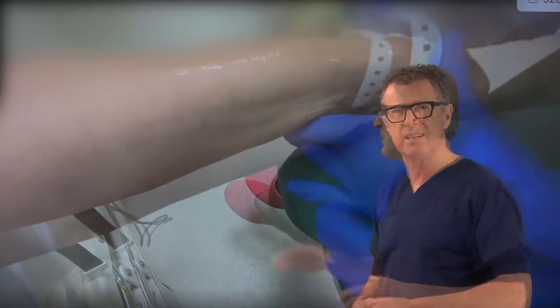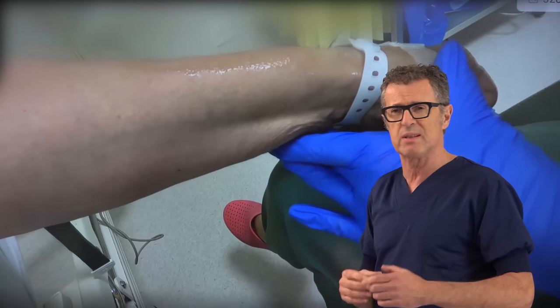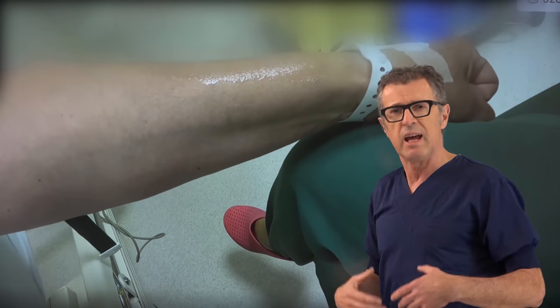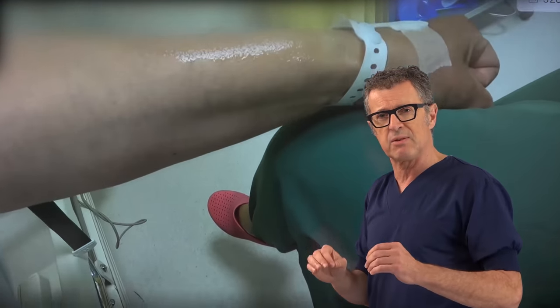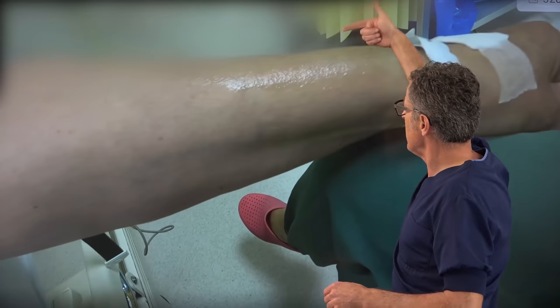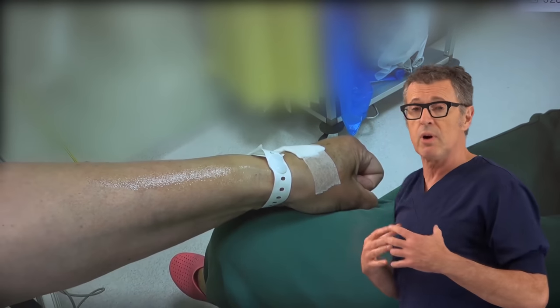Now we stabilize the hand. Tensing the skin stabilizes and fixes the vein, making it a lot easier for the catheter to make its way inside the lumen. We prefer to bend the catheter very slightly, because bending allows you to enter at a very low angle, which is really important.